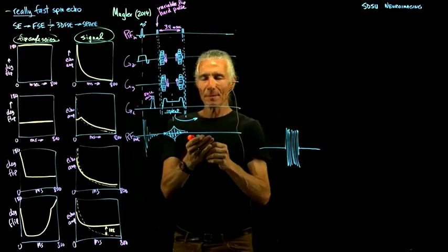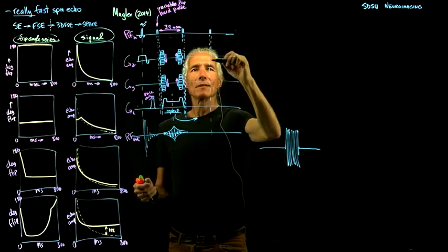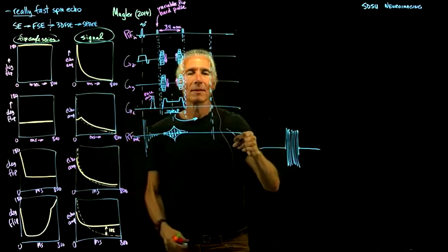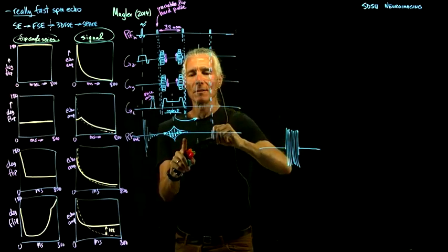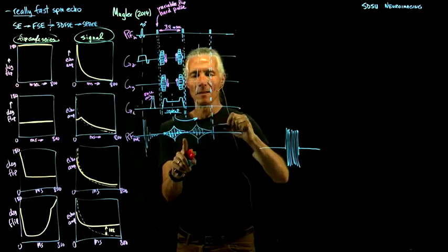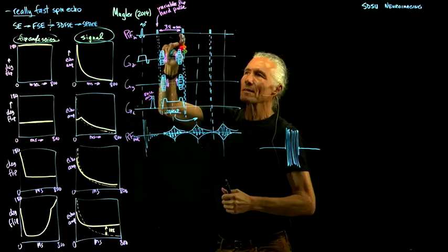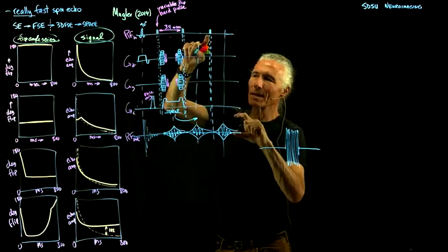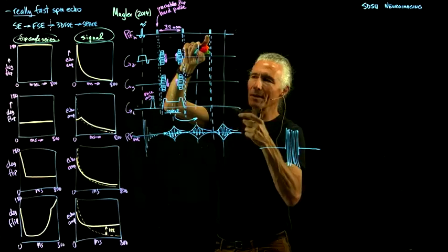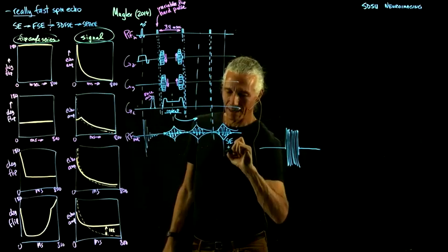But now what happens for the third one, we're going to get, so after the third one, you'll get another spin echo over here. But after the third one, right here, because the second one saved some transverse magnetization in the longitudinal plane, when we do the third one, it will uncover that longitudinal back into the transverse plane, but sort of flip it and cause this rephasing to occur. So basically this guy will be a stimulated echo, plus a spin echo plus a stimulated echo.